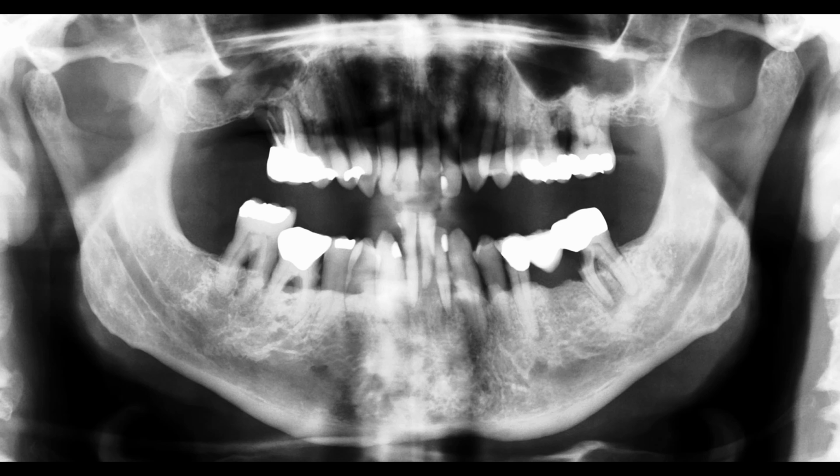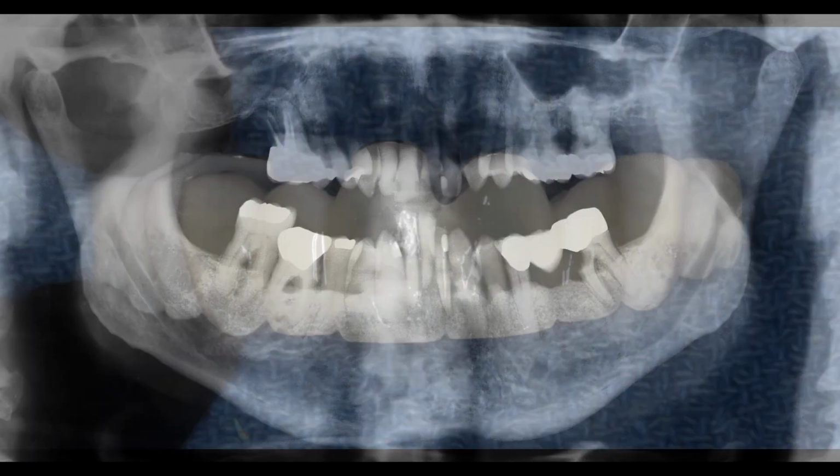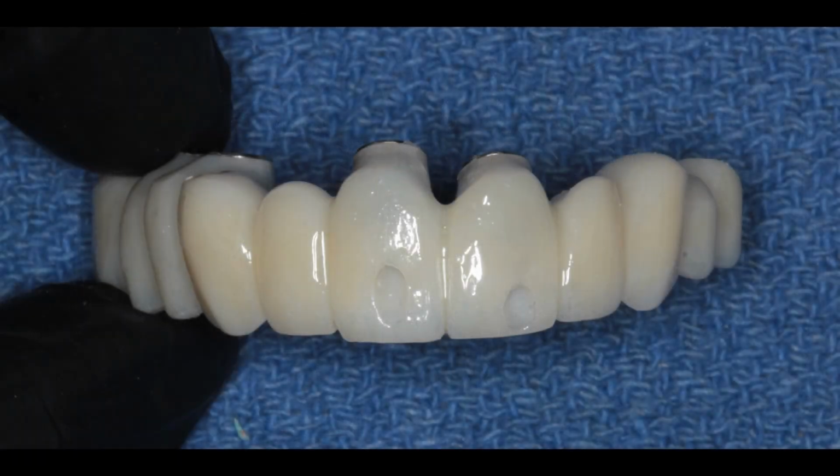And though he doesn't have a lot of bone in the back of his mouth, he's got excellent bone from the premolars forward. And in the lower arch, excellent bone everywhere. So like so many of our other patients, all the teeth were taken out that day, the temporary bridge fabricated and delivered on the same day as surgery.